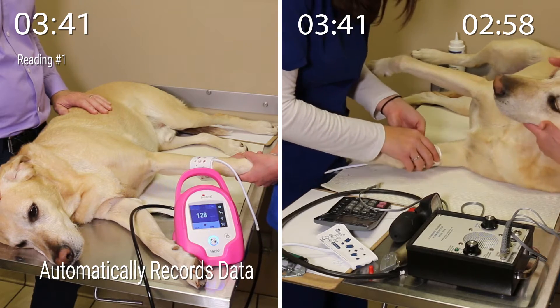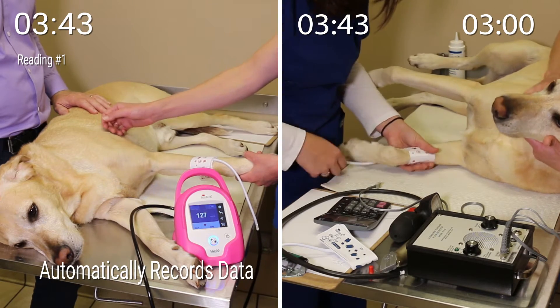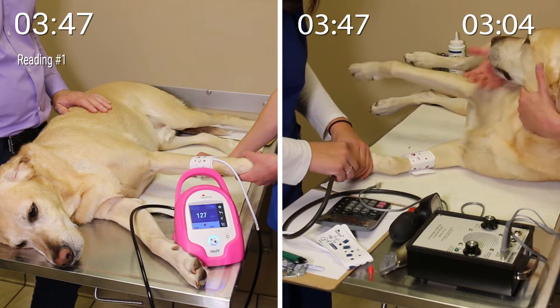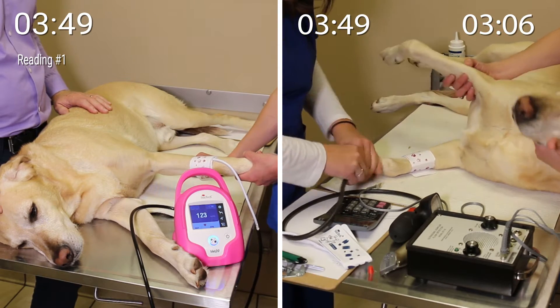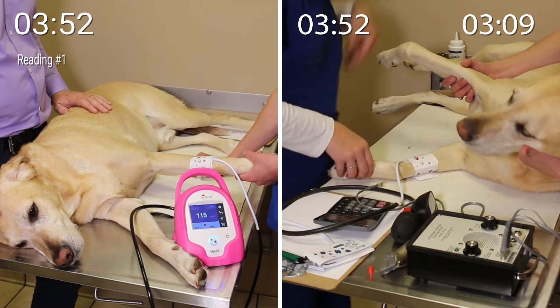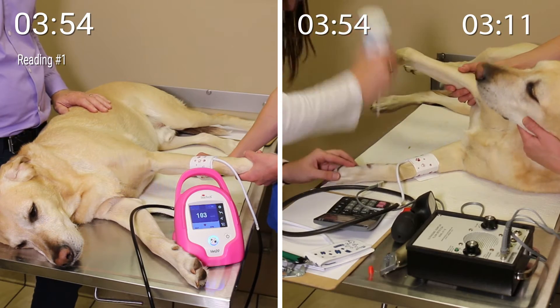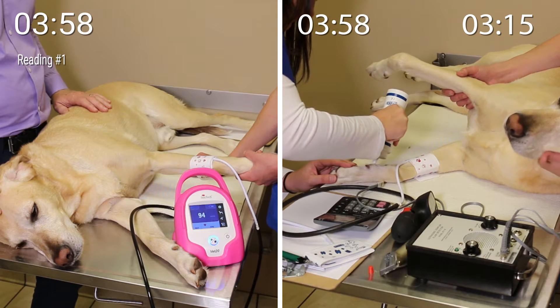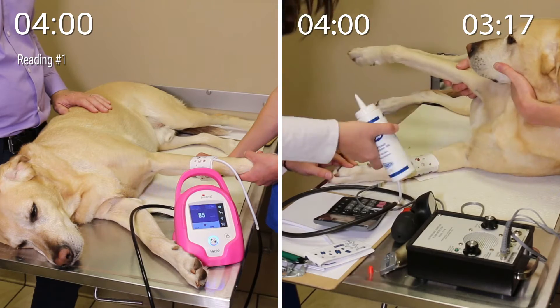The technicians on the right side have sized Tucker for a blood pressure cuff and will now re-attempt to use the Doppler crystal. She is reapplying the acoustic gel, which is important because it conducts the ultrasound waves to the crystal. Gel is placed on the concave side of the crystal, and once it is applied, the crystal is placed firmly against the skin above the artery.